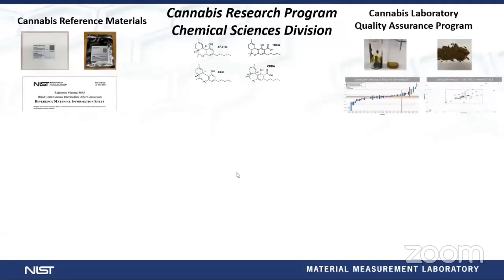In conjunction with that, we've also been working on what's called the Cannabis Laboratory Quality Assurance Program, CANQAP for short. This is an interlaboratory studies program almost identical to proficiency testing, except we do not provide you with a pass, fail, or grade. You get homogenized plant materials that were prepared either by NIST or obtained from leaders in the industry, to evaluate your capabilities, but also compare yourself to other people in the industry as well as to NIST.